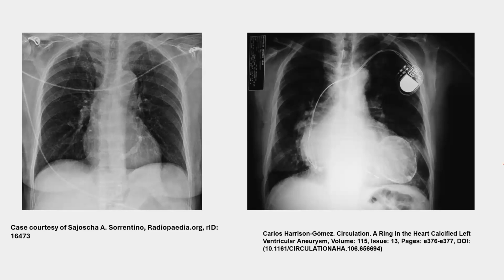Okay. This is a calcification, but of an apical aneurysm. This is apical aneurysm and calcification. And if you look here, you feel that the geometry of the chamber is distorted. There is a sudden outpouching. So this is the aneurysm, and it is overlaid with calcification. So this is not pericardial calcification, but apical aneurysmal calcification.